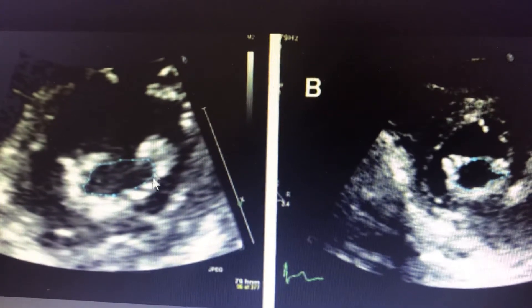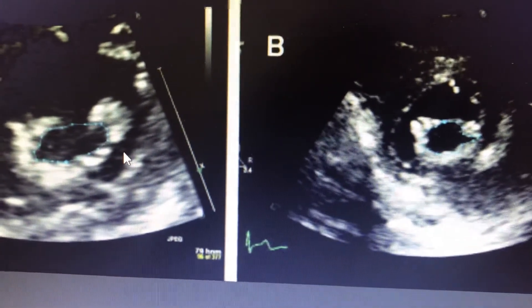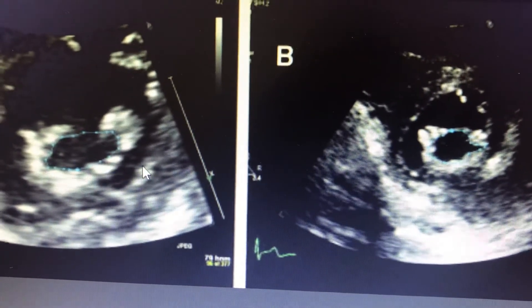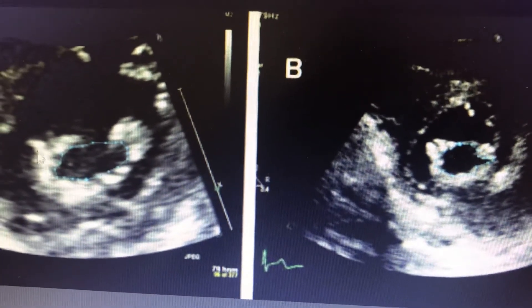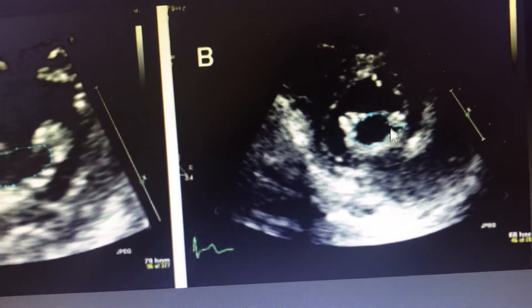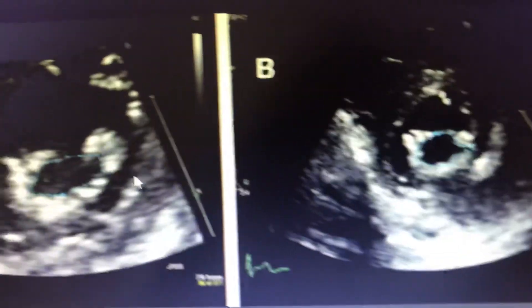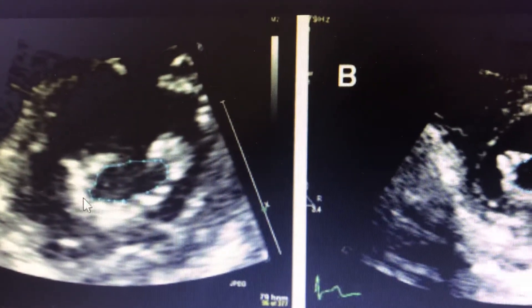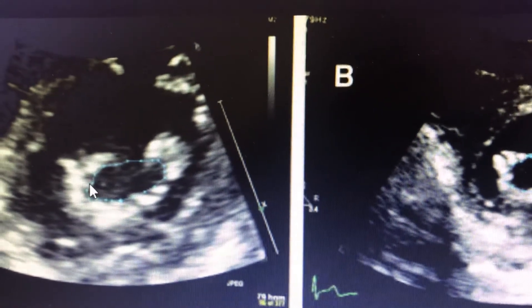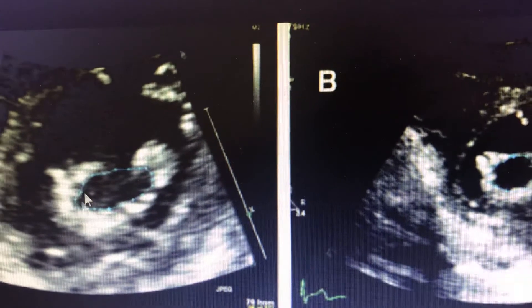In the short axis view, you will look for a few things: complete opening of the mitral valve. If it is not opening, look at the commissures. If the commissures are closed, look for calcification, fibrosis, and subvalvular apparatus in the short axis. If it is severely calcified — with huge commissure calcifications and fused commissures — then most probably the patient will not get any benefit from balloon valvuloplasty.